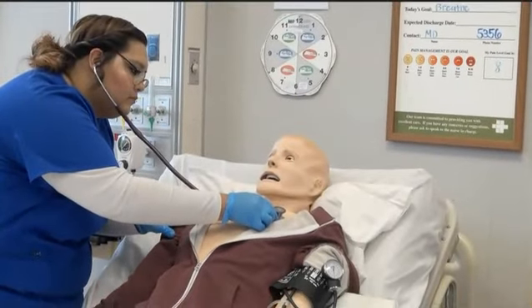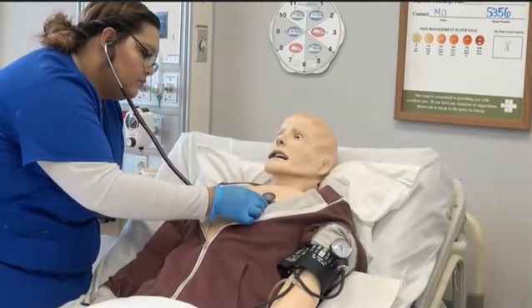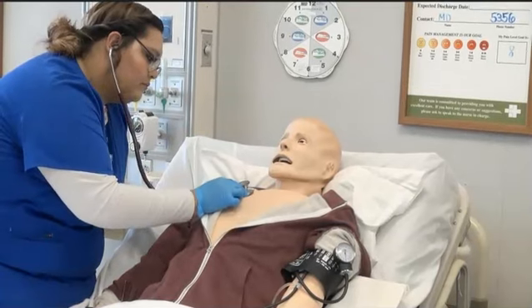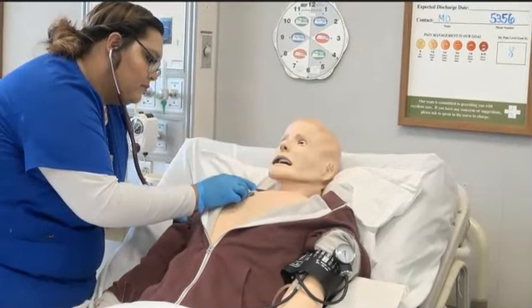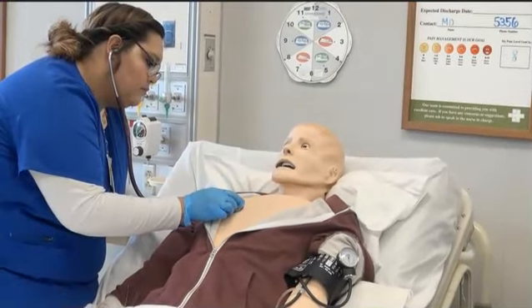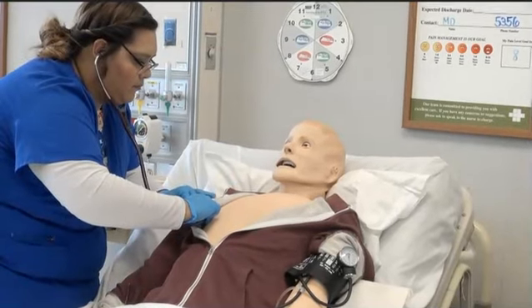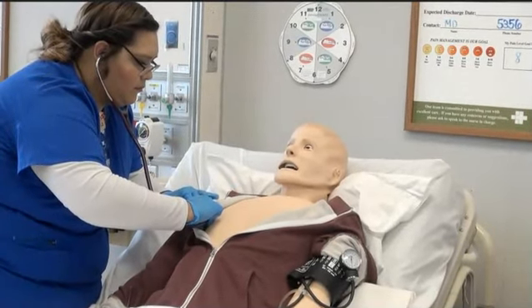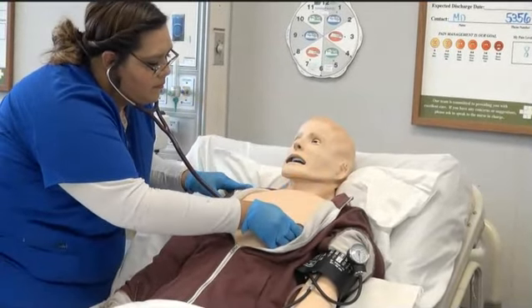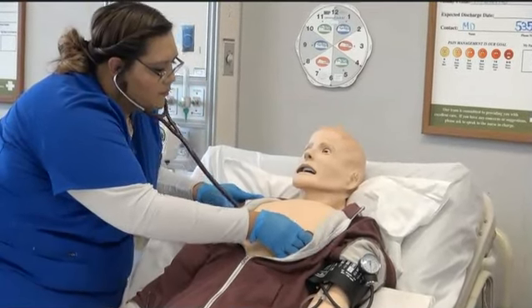Notice she continues to communicate with the patient and politely takes their consent to perform. Assessing breath sounds will be comparing the right lung and the left lung, and back and forth, all the way down through the lung fields, all the while assessing the respiratory rate as well to establish the baseline. Notice how she continues to communicate with the patient.